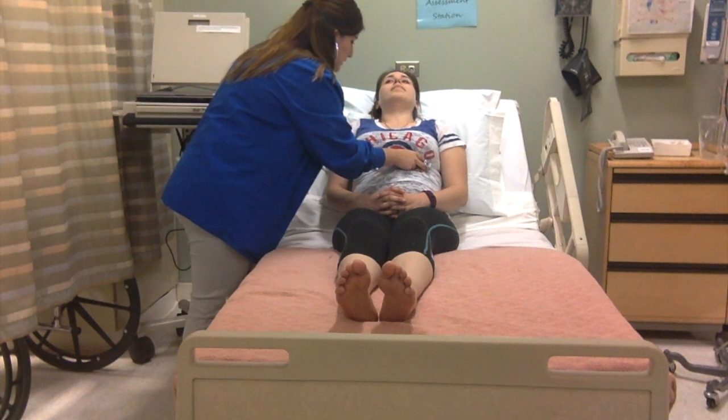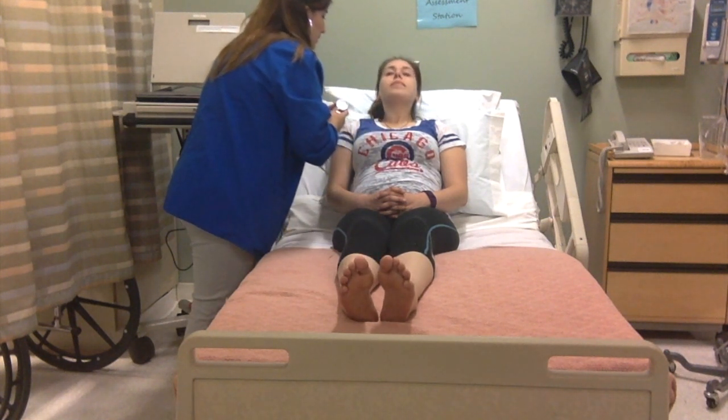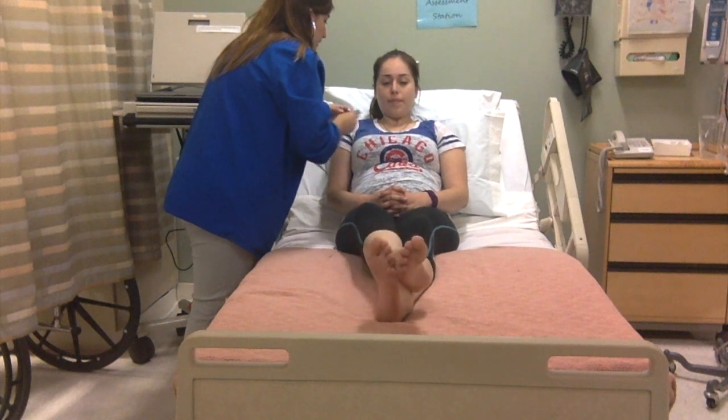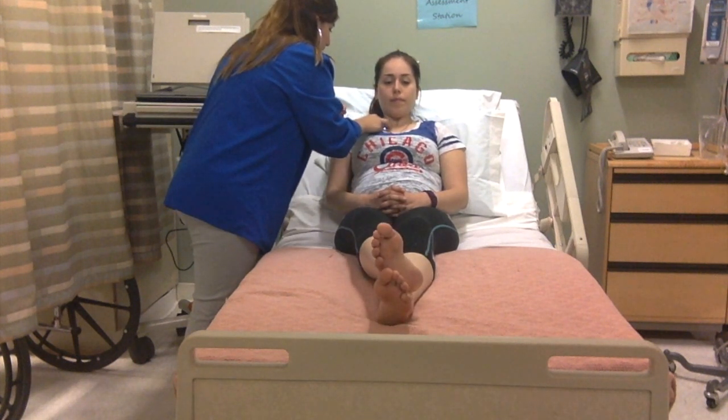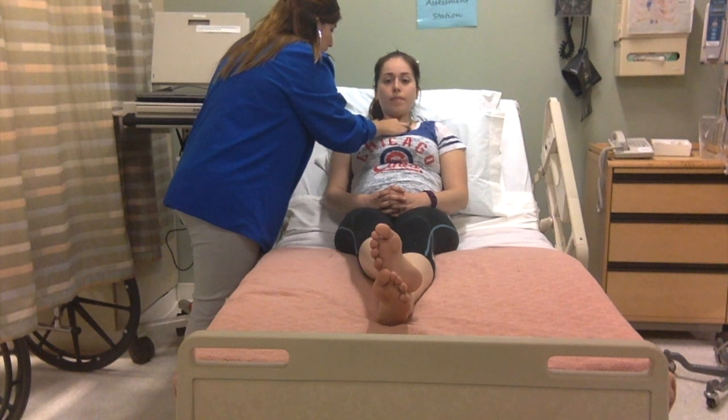Okay, so I would be listening for a minute, and then her heart rate is 70, and then I would be listening for an S1 and S2, which are present. I don't hear any extra sounds or clicks or murmurs. And then I'm just going to listen to your valves, okay? So I've got the aortic valve. Okay, I hear an S1 and S2, and then pulmonic.